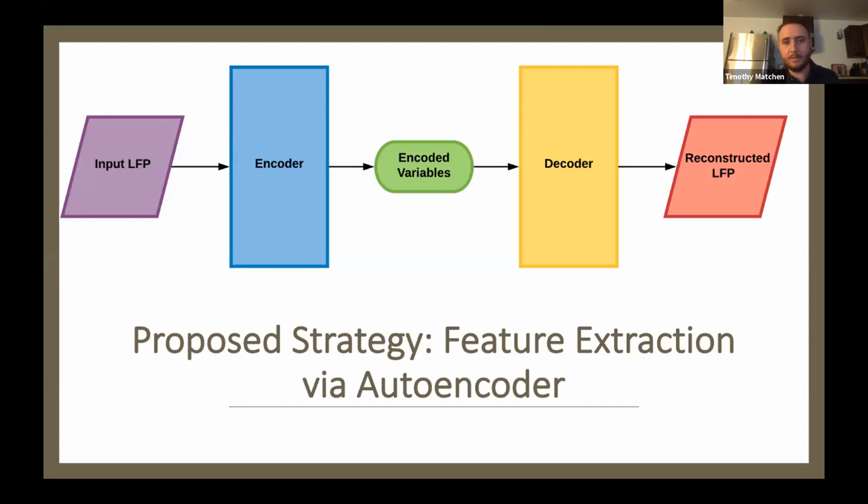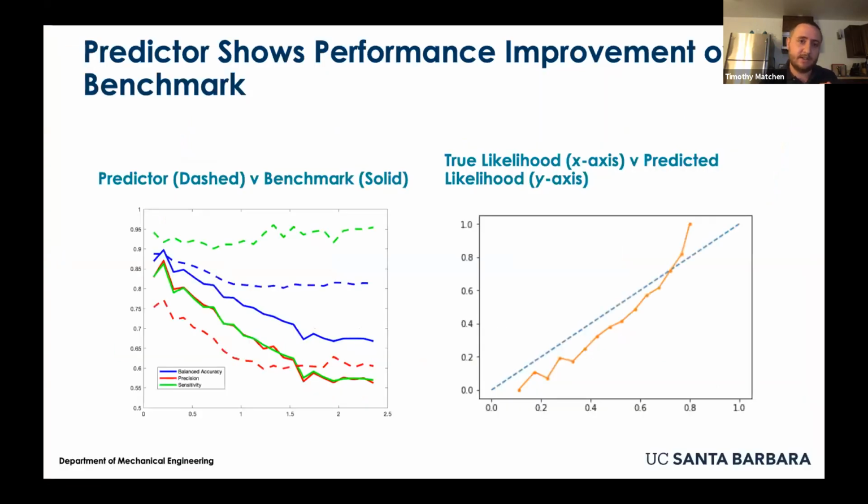So the good news is that when we did this on our training data and compared it to the validation data, we found that we were actually able to get what we think are some really promising improvements over the two benchmarks that we talked about, those Markov decision processes and, again, our quote unquote null hypothesis. There were a couple different areas that we were primarily interested in. The biggest one, of course, was sensitivity.